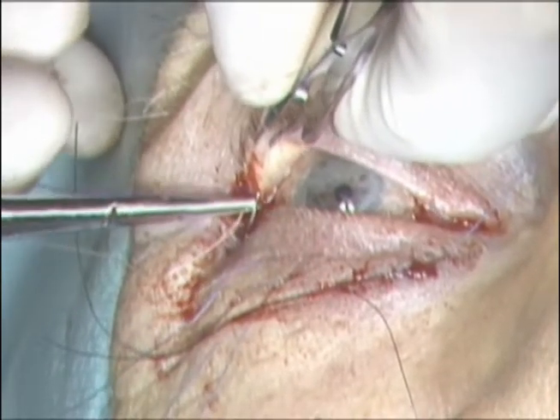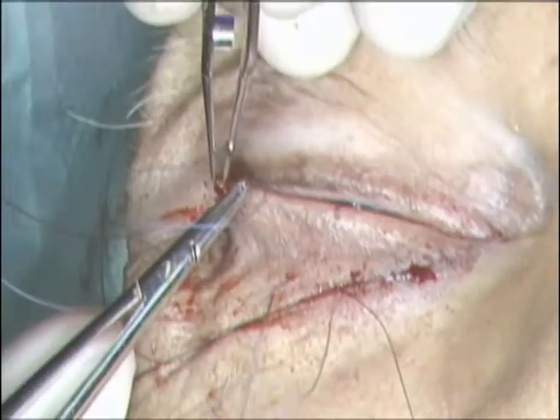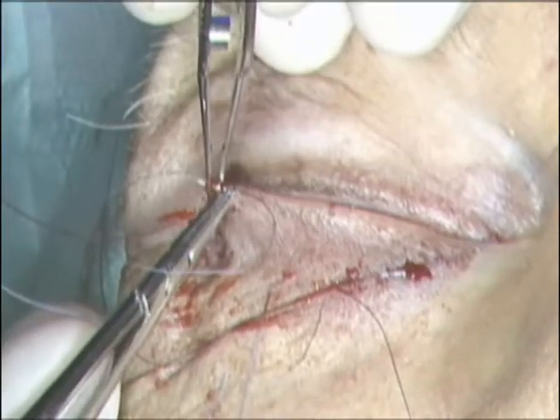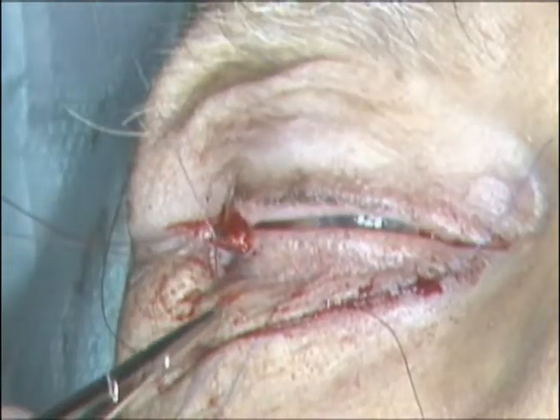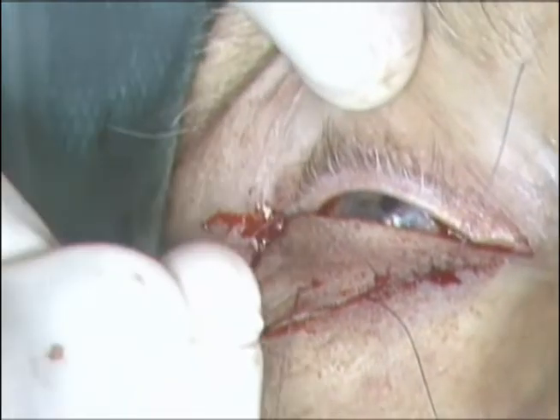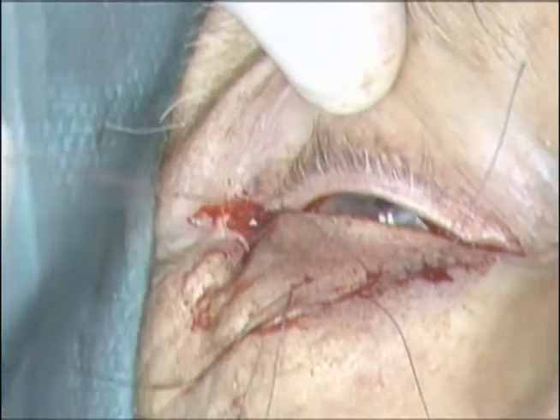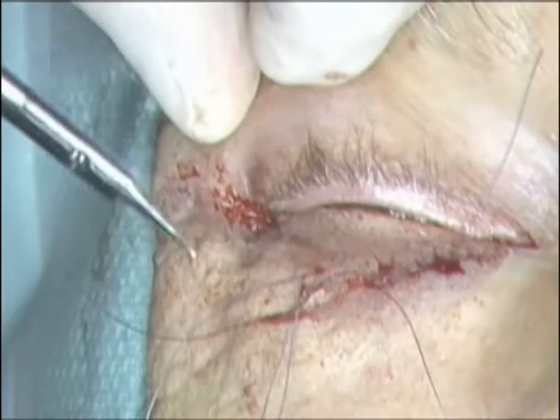Prior to tying the sutures, the lateral portion of the mucocutaneous junction of the upper eyelid is engaged with a 5-0 Vicryl suture. This suture then engages the superior border of the lateral tarsal strip and is tied. This attaches the lateral upper lid to the lateral tarsal strip. Tying the lateral tarsal strip then tightens both the upper and lower eyelid.